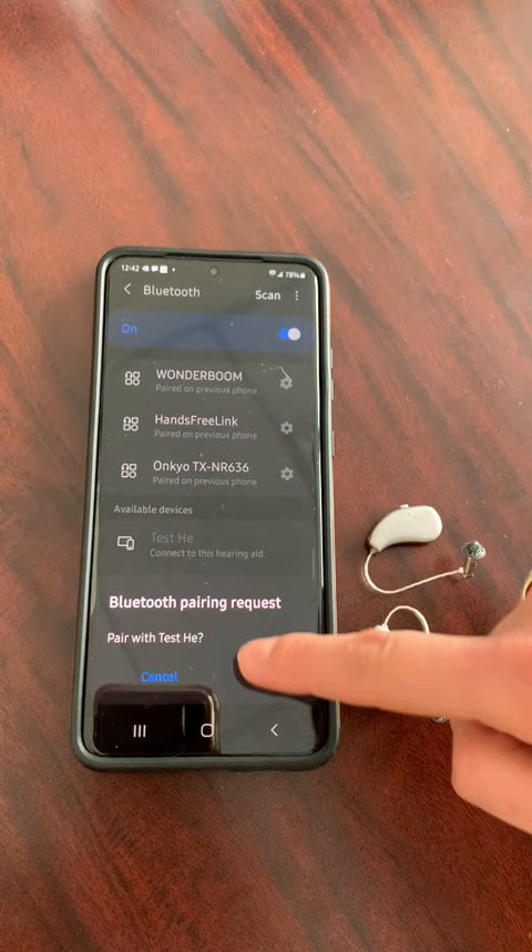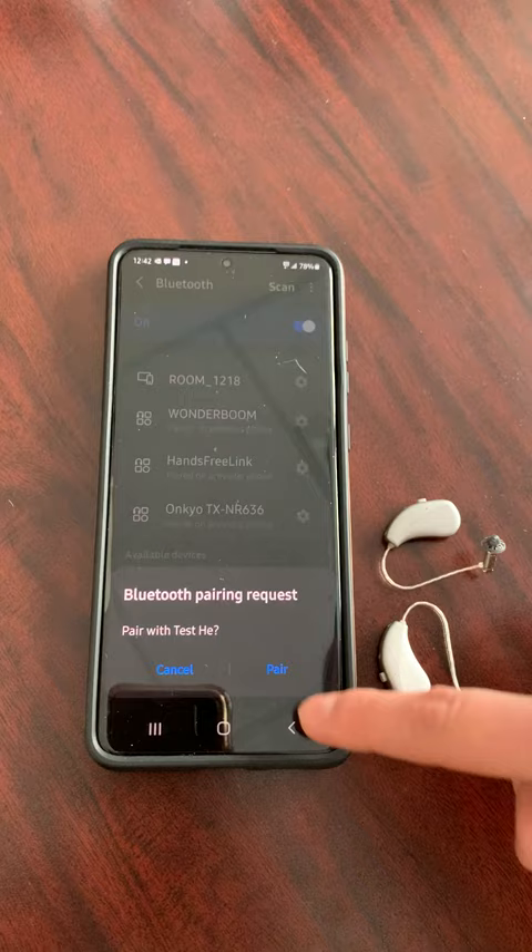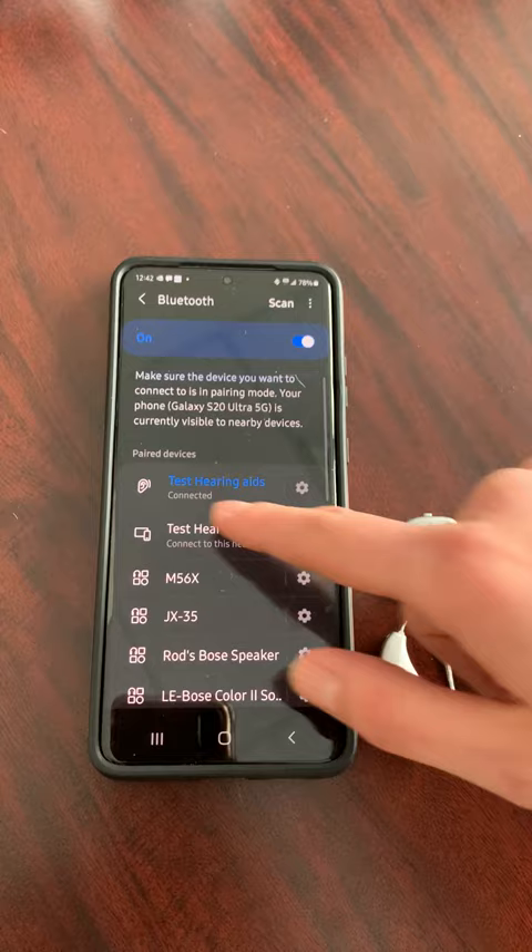And then test pair. These are labeled as 'test hearing aids pair,' and now they're connected right here.